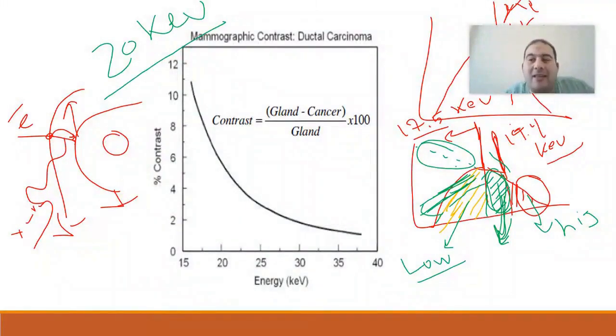Now, the part that is in the high energy is essentially the part that will come out in the spectrum. It's not large. Why? Because I am operating my machine at 35 kilovolts. That means the maximum photon energy emitted in the spectrum is 35. So the high energy part will be close to the K edge of the filter, and the filter can provide attenuation. So it's as if you have removed a significant part of the high energy and a significant part of the low energy, and you have kept the characteristic part, which is what you will rely on for imaging.